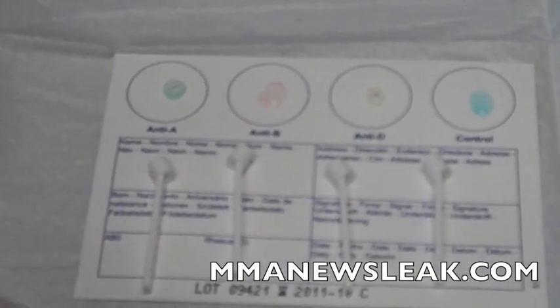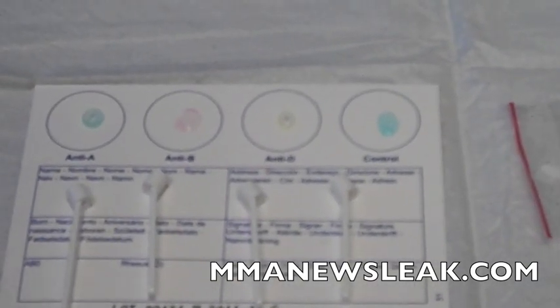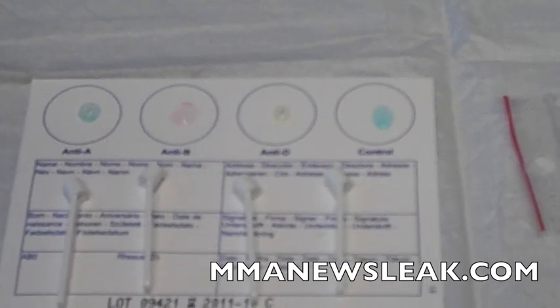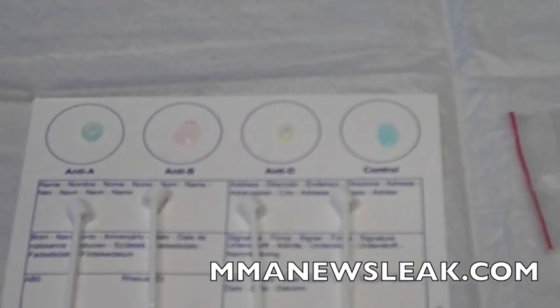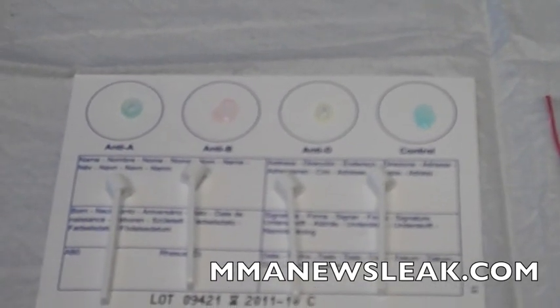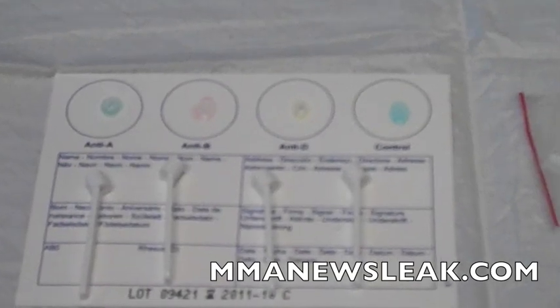Anti-A is going to clump up if you are A. Anti-B is going to clump up if you're B. If you're AB, they're both going to clump up. And if you're an O, neither will, because O is the only one that doesn't have any protein markers on it for A or B — it won't clump up with a protein marker that would destroy the blood cell.